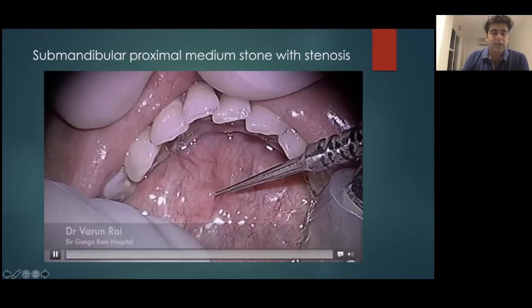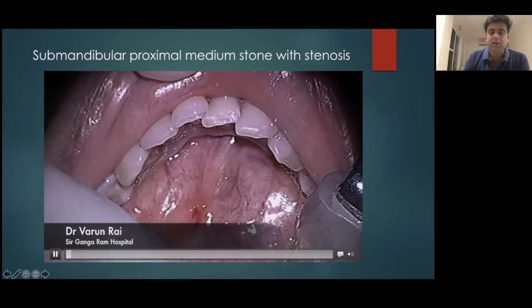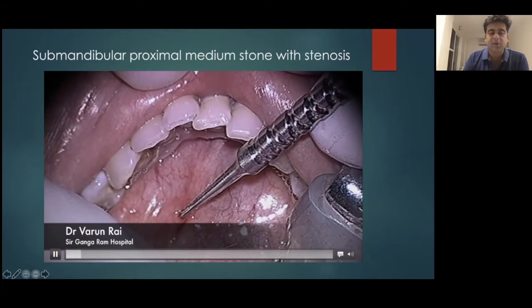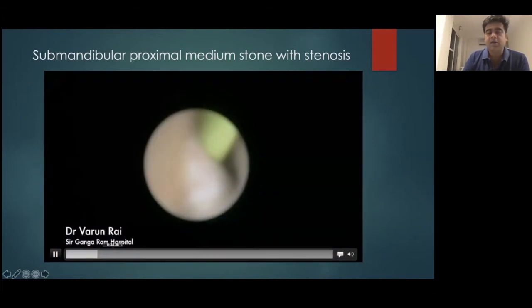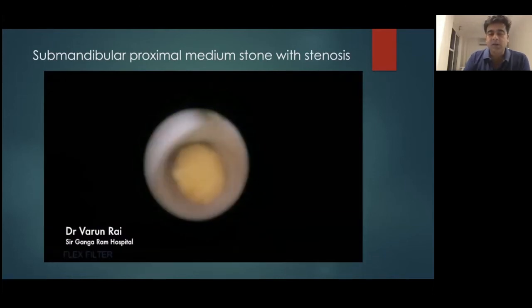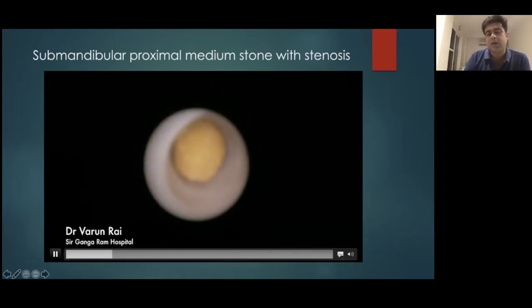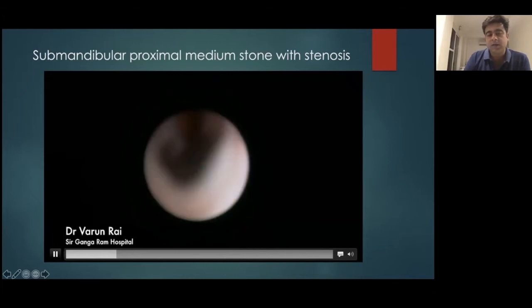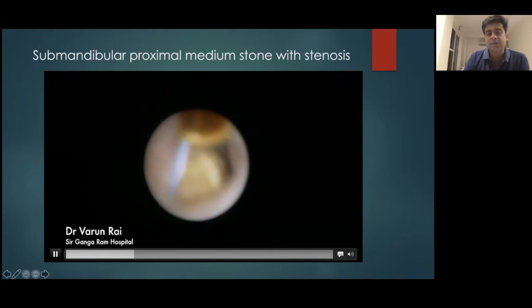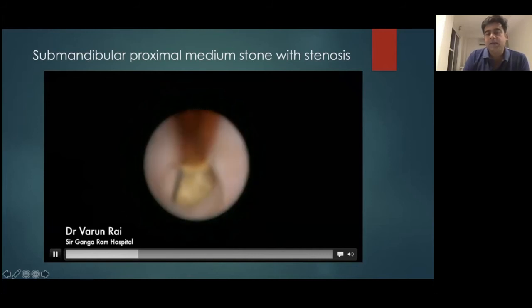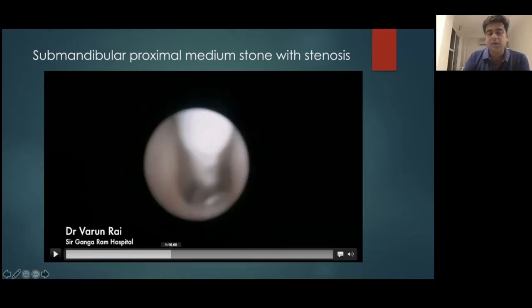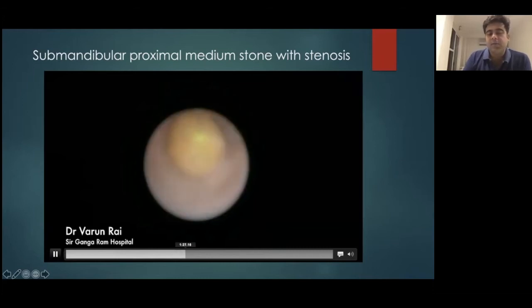What happens when a stone is stuck behind a stenotic segment or is larger than the diameter of the duct, impeding easy basket extraction? In this case, you see a guide wire and a narrowed segment. Once we bypass it, we see the stone — it's small and floating inside — but when we try to basket it, it gets stuck at the stenotic segment. The idea was to dilate that segment to facilitate basket extraction, but that did not work sufficiently to really facilitate extraction.